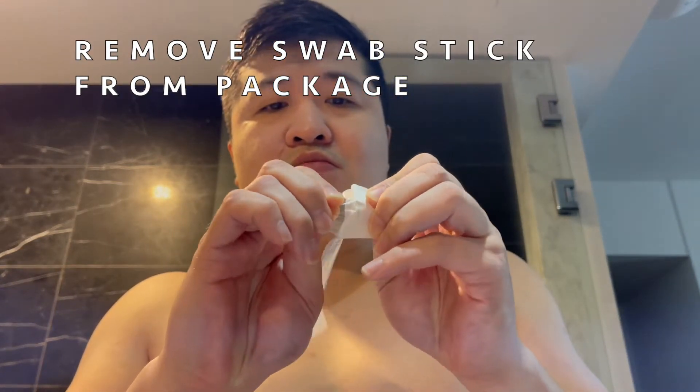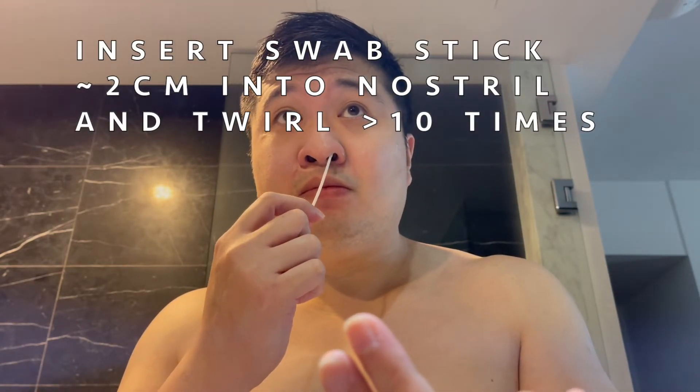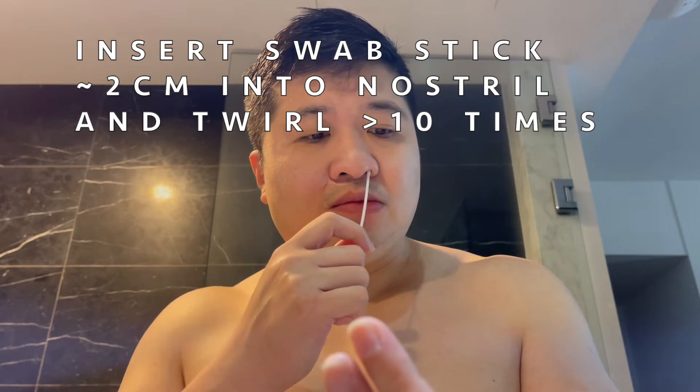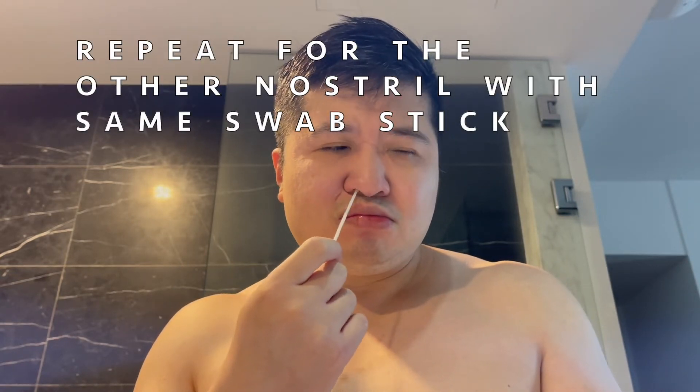Remove swab stick from package. Insert swab stick about 2cm into nostril and twirl more than 10 times. Repeat for the other nostril with the same swab stick.